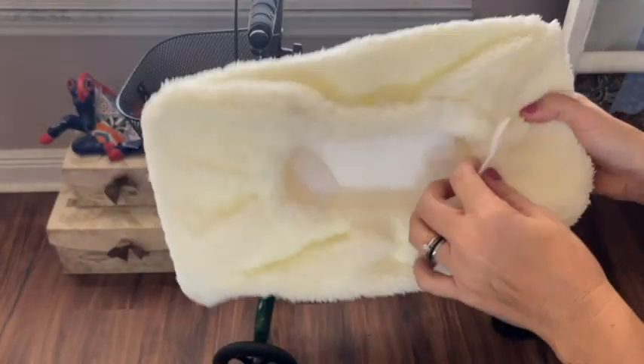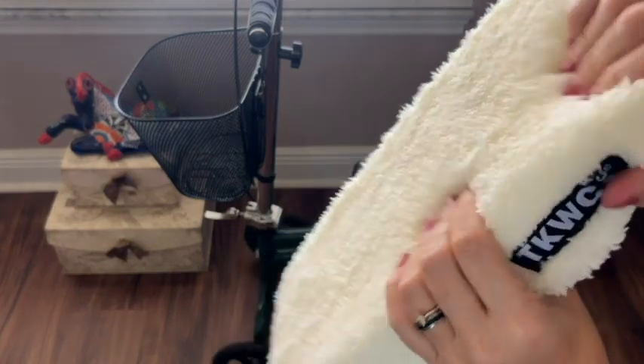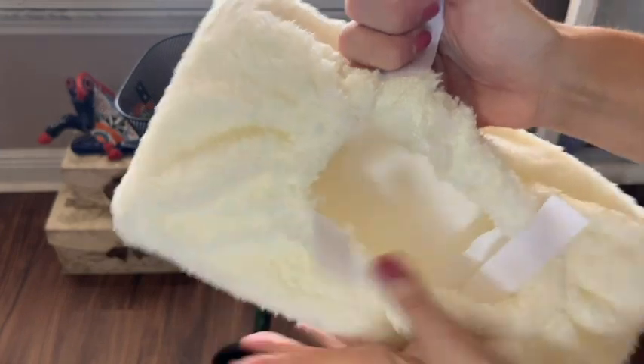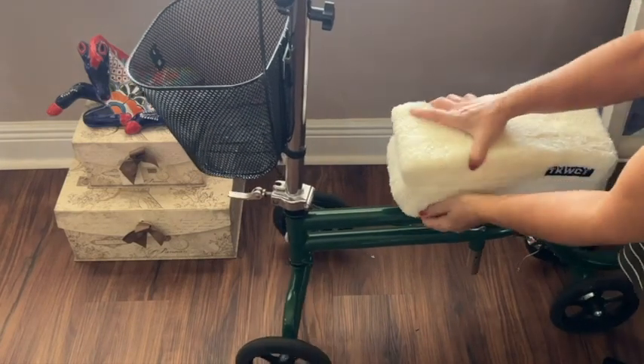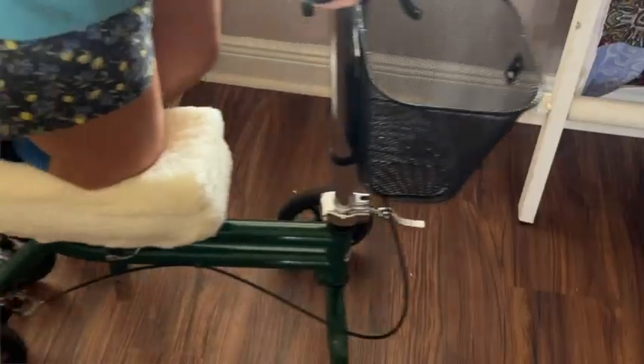The foam is very stable and supportive, and this outside cover is very soft. But I appreciate most the straps that make it really secure and that elasticized cover, so it's really simple to install it over the existing cushion on your knee scooter, and then you use that velcro to keep it stable.